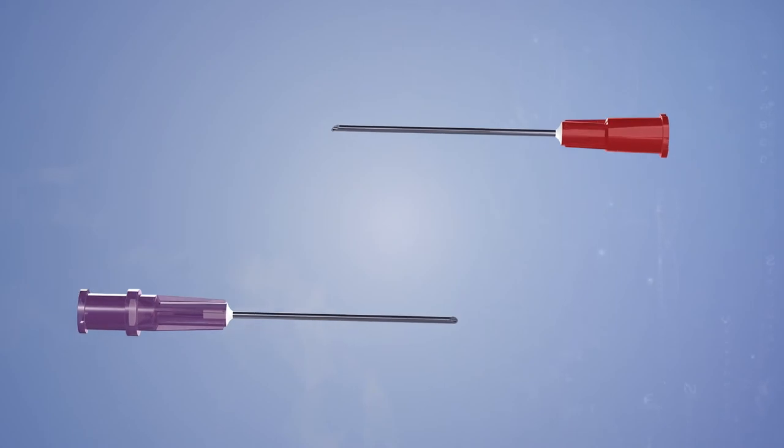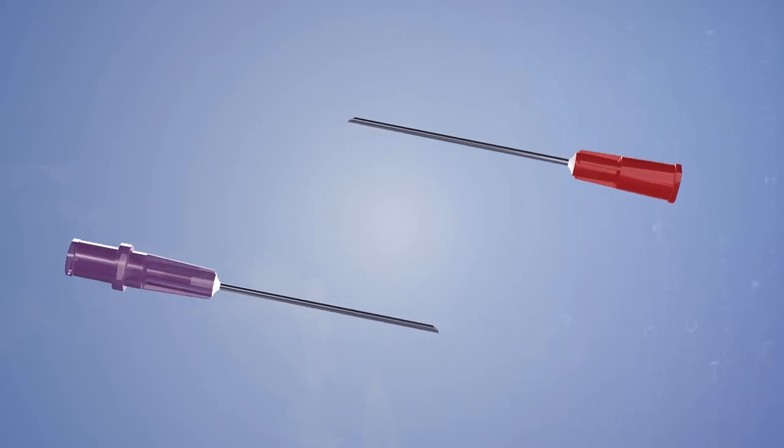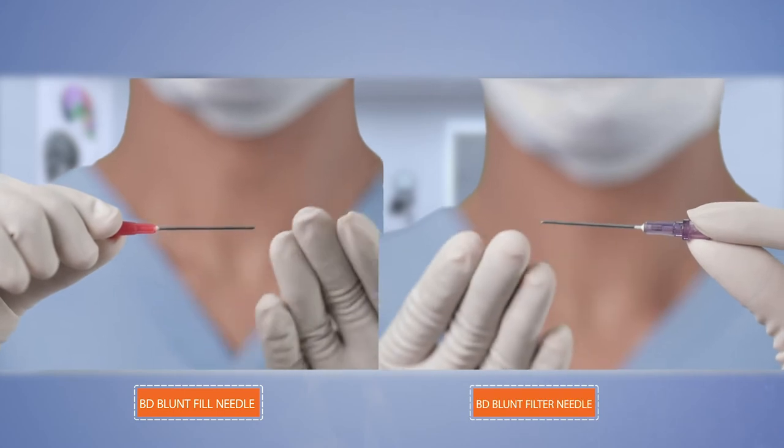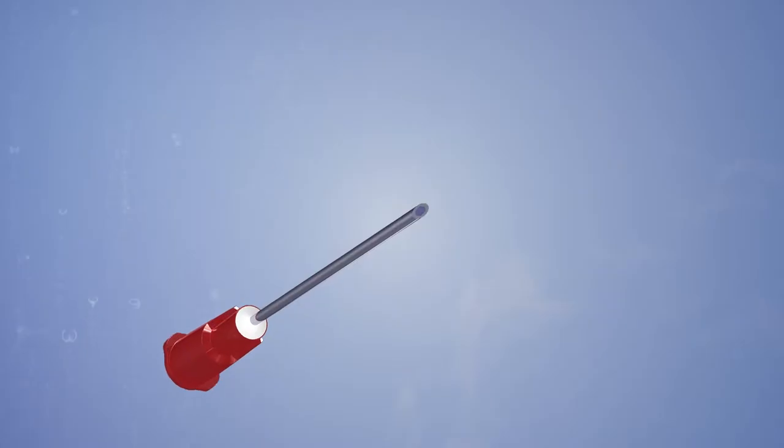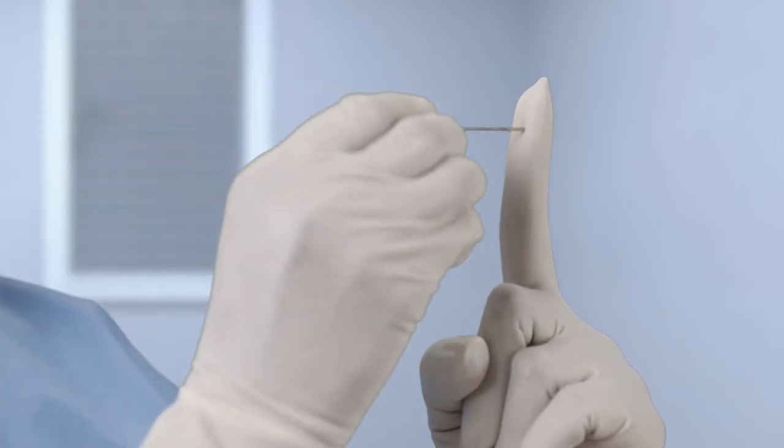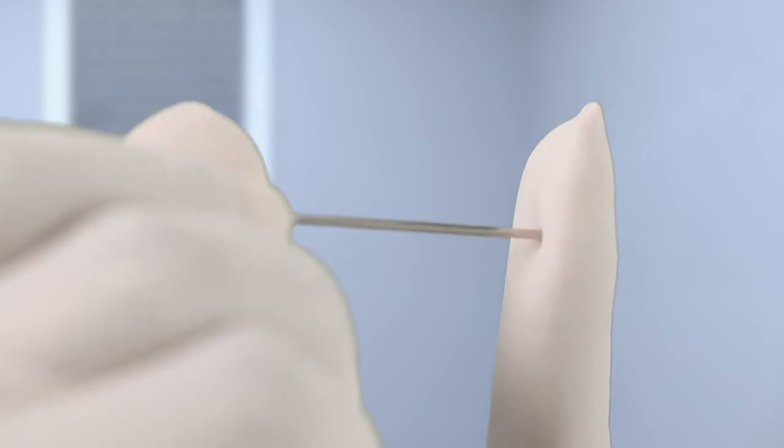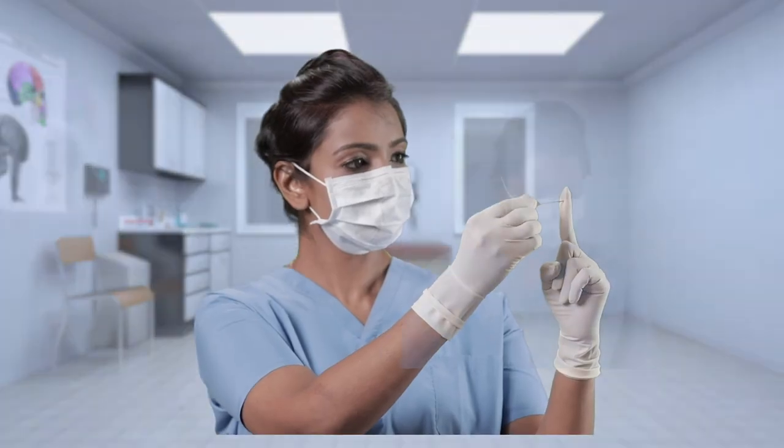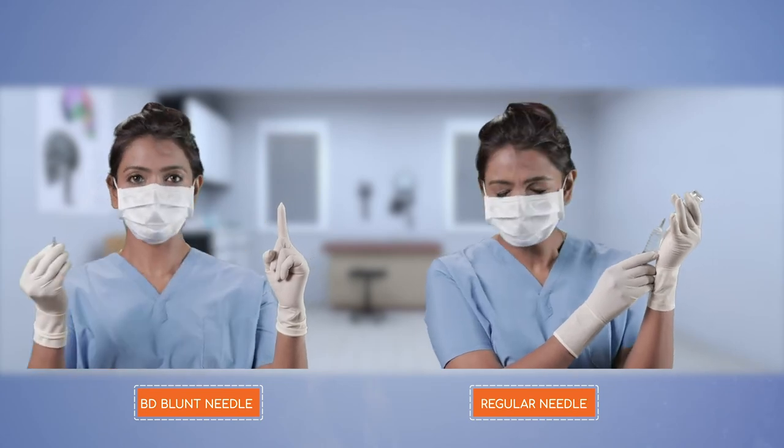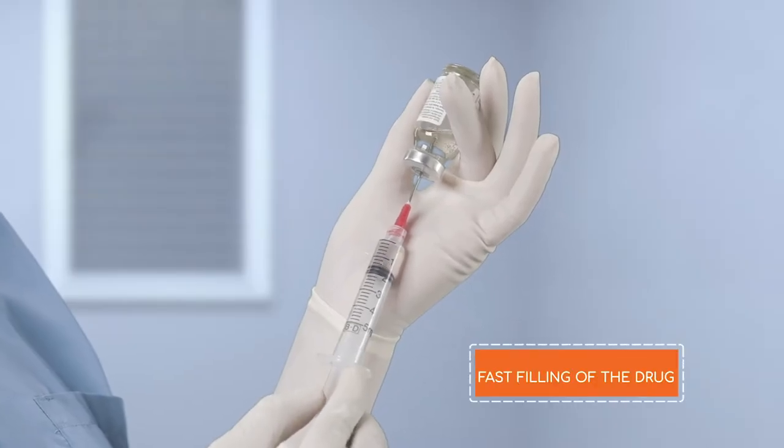BD can help minimize these needle stick injuries through its blunt fill needle and blunt filter needle solutions. As the name suggests, these needles are blunt, and even if they accidentally touch the skin, they require 10 times the force to penetrate the skin as compared to a conventional needle. The filling of the drug is also fast because it can cope with more viscous medications.